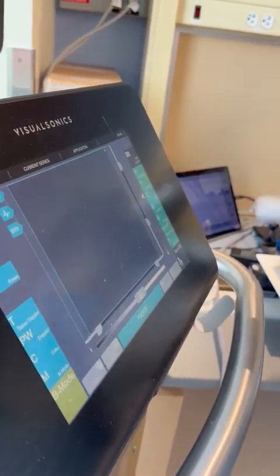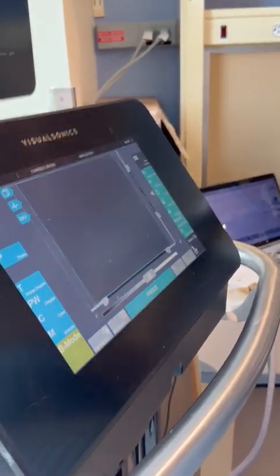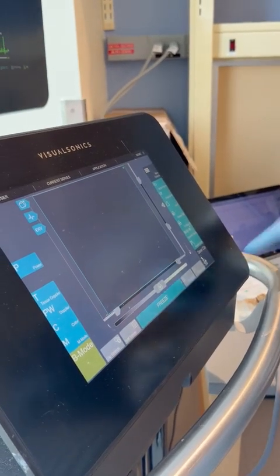We're just removing the offset. We're just eliminating that from the display. Okay, so we can save that. Perfect. And then if you want, just hit name image.